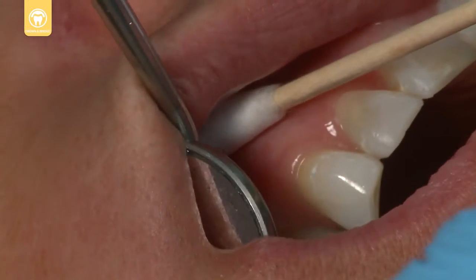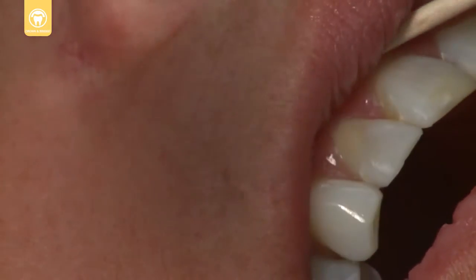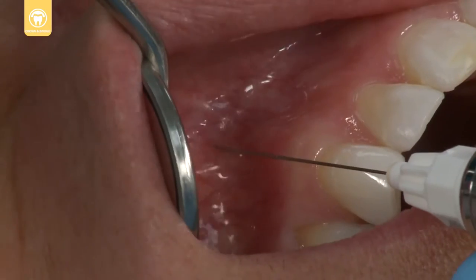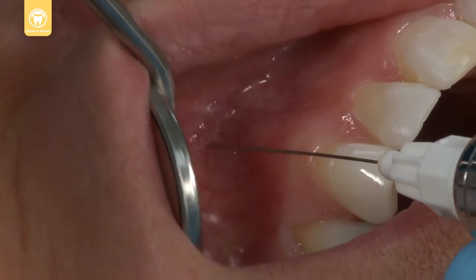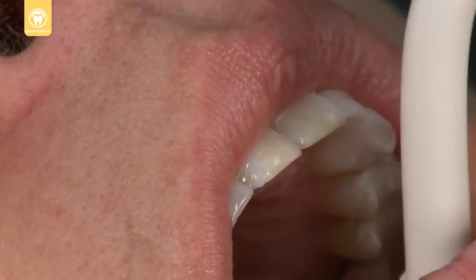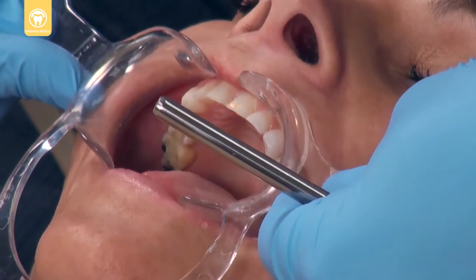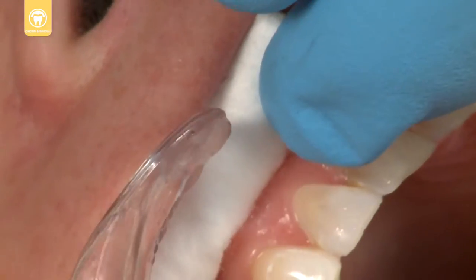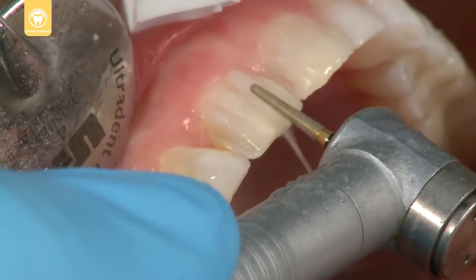Place UltraCare topical anesthetic and anesthetize. Rinse and vacuum before isolating the preparation. Cut the veneer preparation.